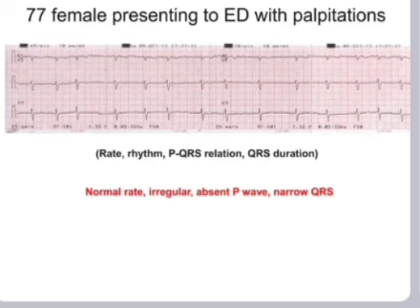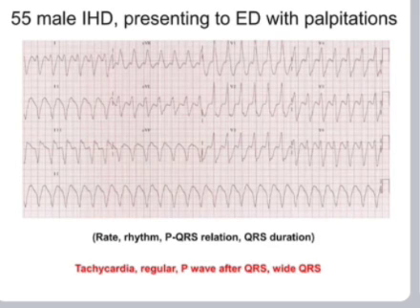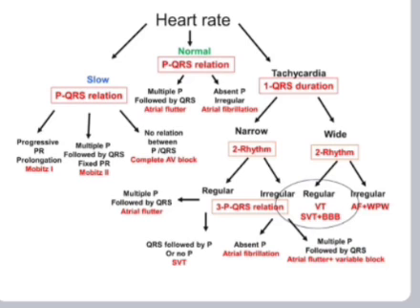Case 1: This ECG shows normal rate, irregular rhythm, absent P waves, and narrow QRS — this is atrial fibrillation. Case 2: A regular tachycardia with P after QRS and wide QRS duration — this is ventricular tachycardia (VT).